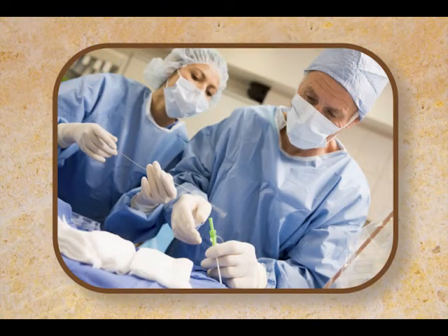accessed so they can walk, and typically what they do is they get a little pressure thing. It's probably about this big that sits over the radial artery. It's a little pressure device, and that'll stay on there for an hour or so, and then it comes off, and they can walk out of the hospital. But this is really a minor procedure.